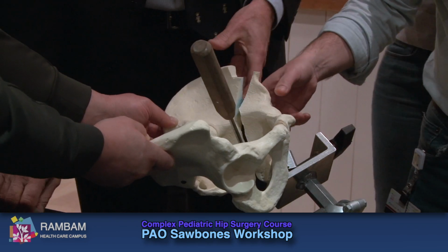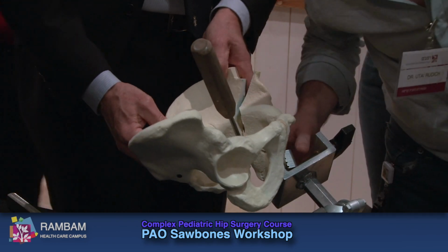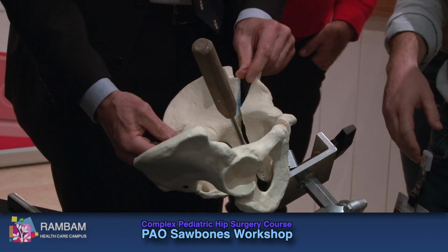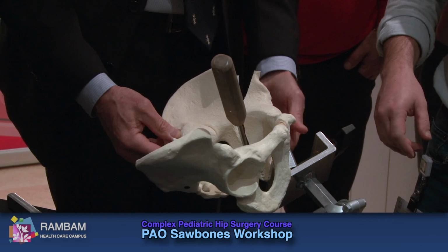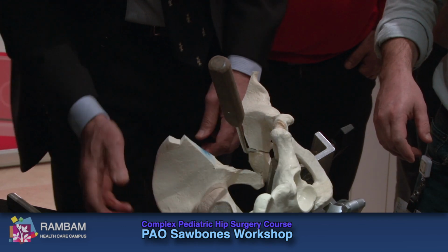This is often the sticking point. So this is what happens in reality. You've got this part, this is what you see. Now this thread here, now this thread here. Because you do the corner here. Now you can see here.